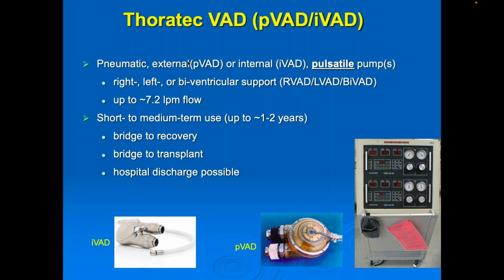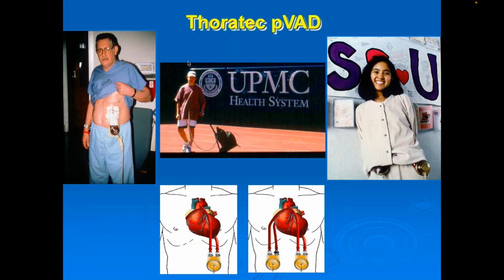You can look at the devices on the side of the screen and on the bottom, the IVAD versus PVAD, for internal versus external placement. And in this photo here, you can see that these are the external placements, as they are outside the abdominal wall.